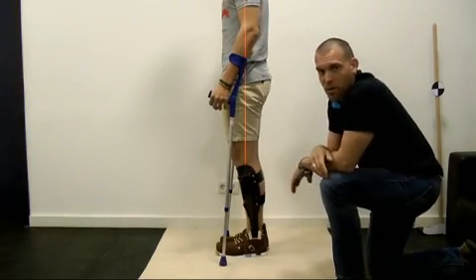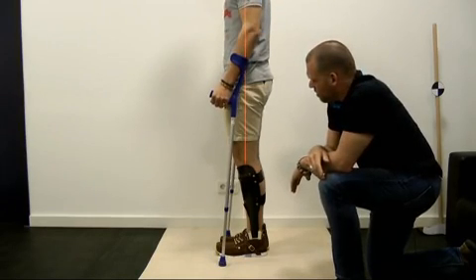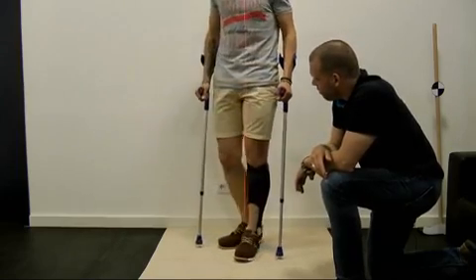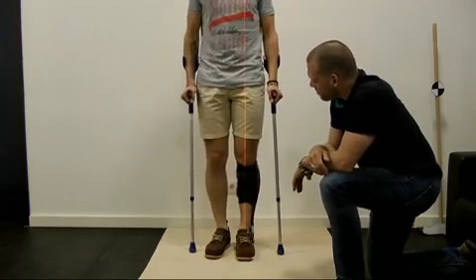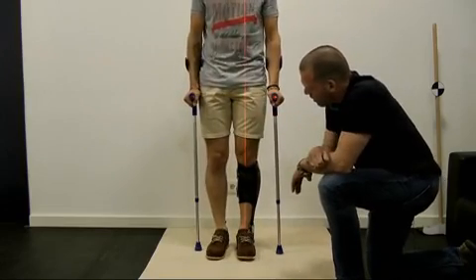Okay, now what's next? Henrik, what else did we want to check? We definitely wanted to check how we can recognize the resistance of an orthosis if we look at the whole thing again from the front. From the side we have done some tests, we have looked at whether Henrik was able to stand stable in the orthosis or not.